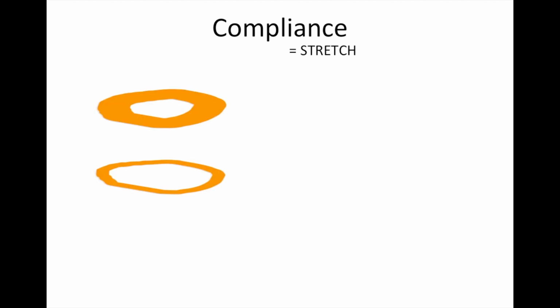The last concept we need to understand before getting to vents is compliance. Compliance is how stretchy the alveoli are and how easily the lung can inflate with a given pressure. We have two rubber bands here that represent two different lungs.